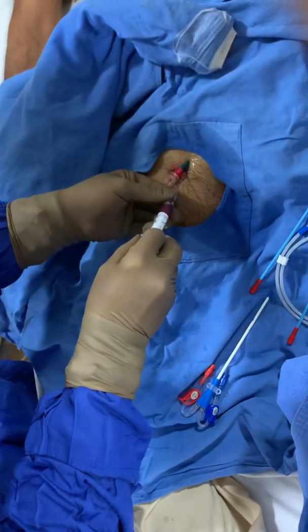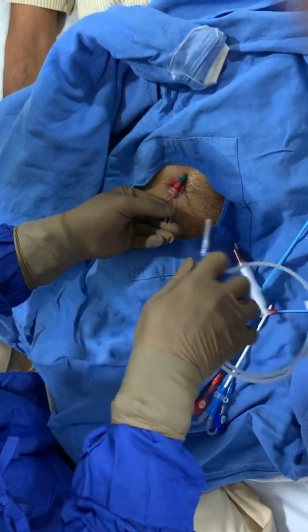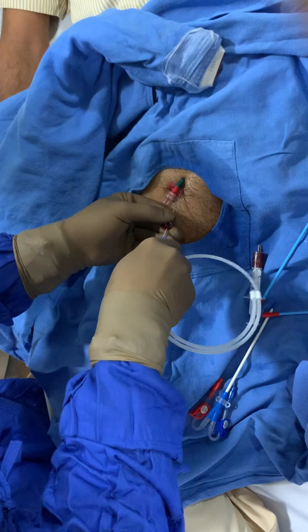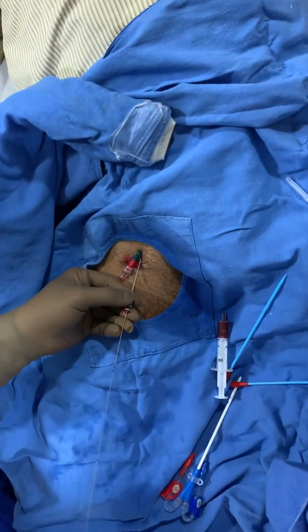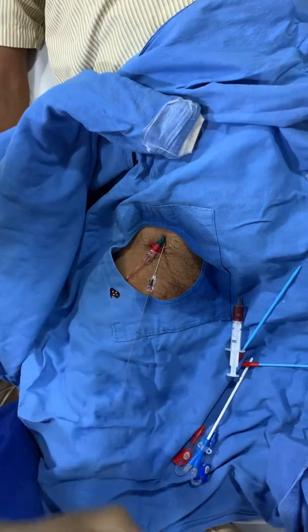Where I get the vein. I'm going to take it out, pushing the guide wire in, which is now in. I've advanced to the maximum.